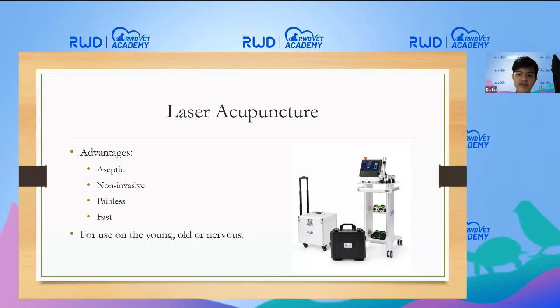Perhaps the greatest advantage of laser acupuncture is that it's completely painless. Most patients feel nothing at all during laser acupuncture, but it is believed that some may feel a chi shift in their body or an energetic sensation propagating along the meridian being treated.